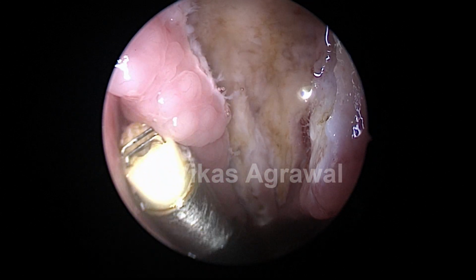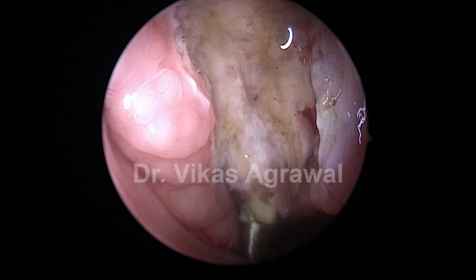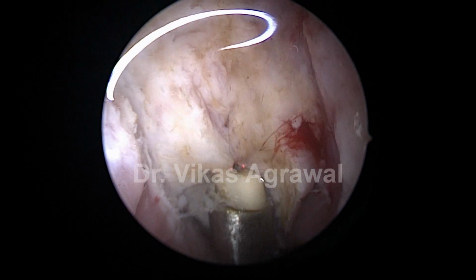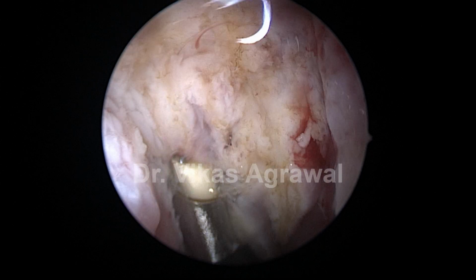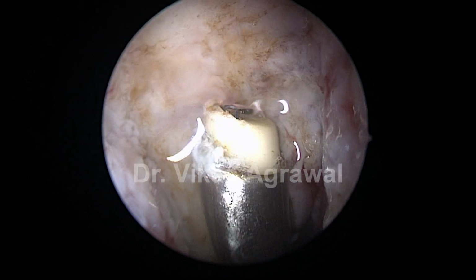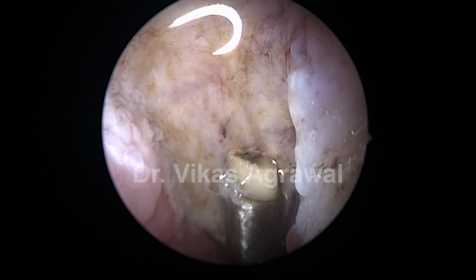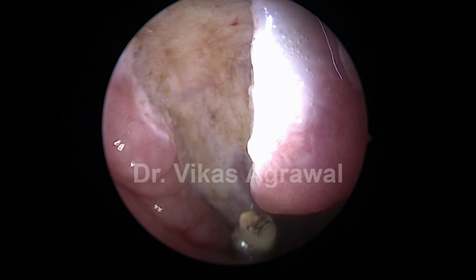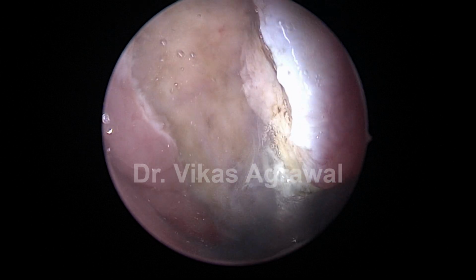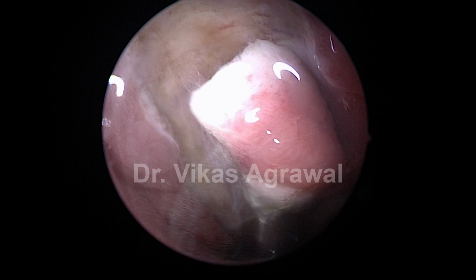So this is the torus tubarius here. You can see the eustachian tube. A lot of lymphoid tissue on the torus tubarius. I'll have to take care of them as well. Let me first debulk the main volume of the adenoid and then I'll come back to you for the boundaries. So this is the adenoid from the left hand side, but since I can see it very well, I'm debulking it.